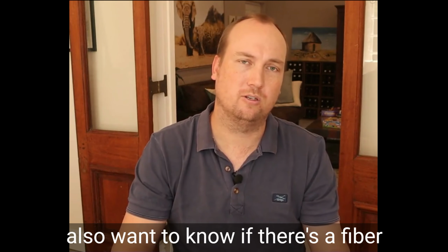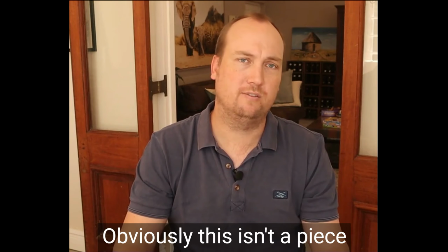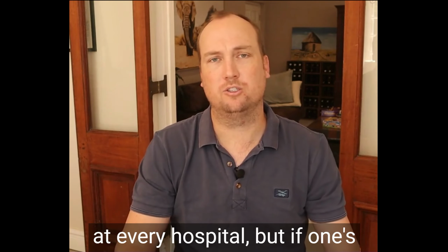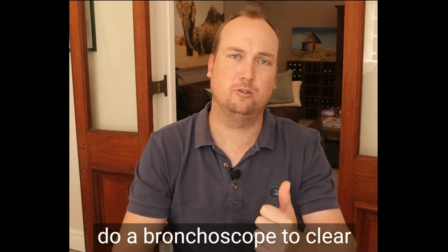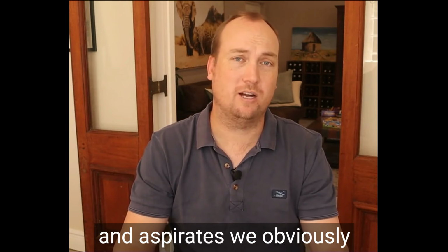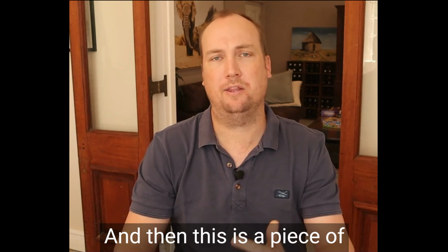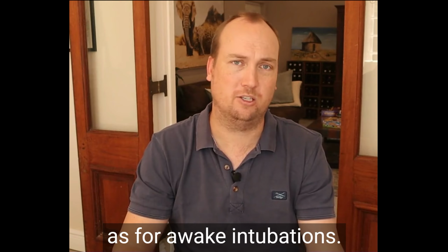And then in my particular setting, I also want to know if there's a fiber optic bronchoscope available. Obviously, this isn't a piece of equipment that's available at every hospital, but if one's giving anesthetics to sick patients, we may need to do a bronchoscopy to clear mucus plugs from the lungs. Any patient that vomits and aspirates, we obviously need to do a bronchoscopy there to clear their airways. And this is also a piece of equipment that one can use for awake intubations.